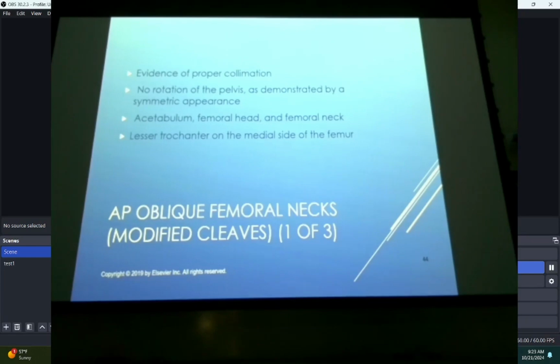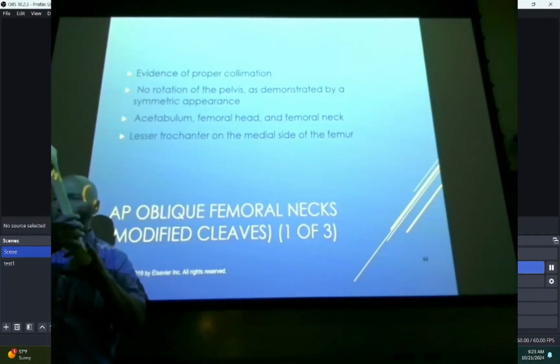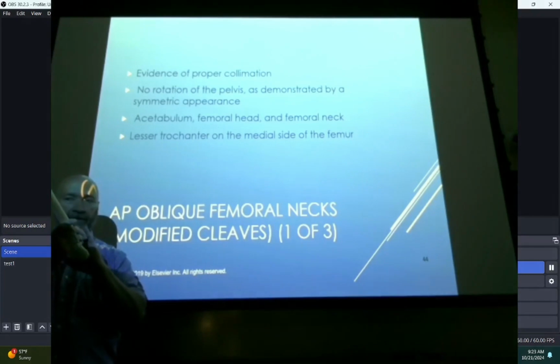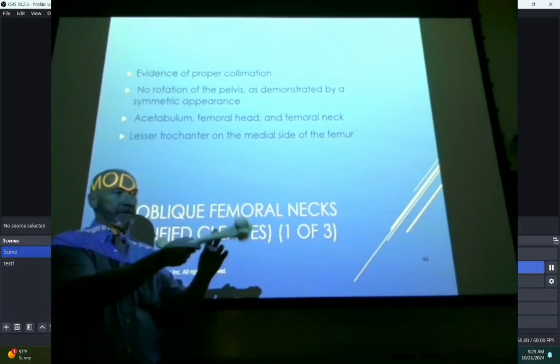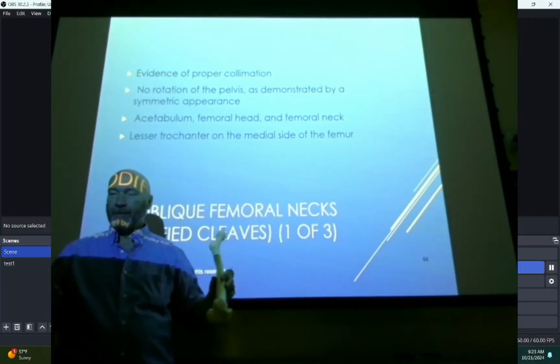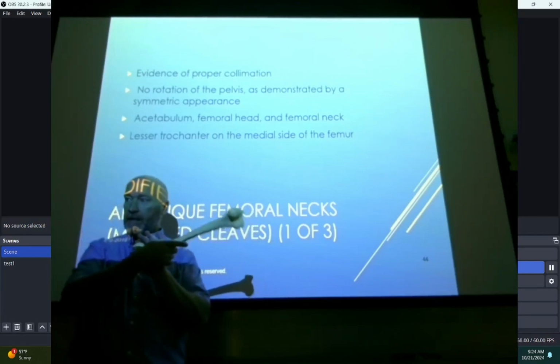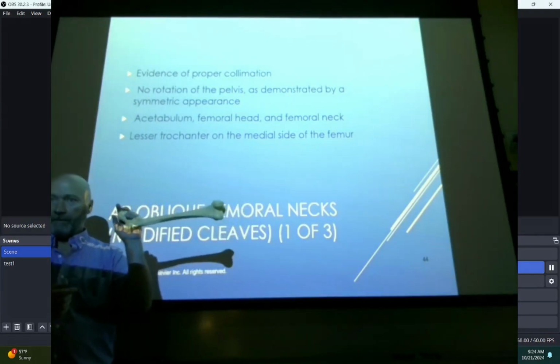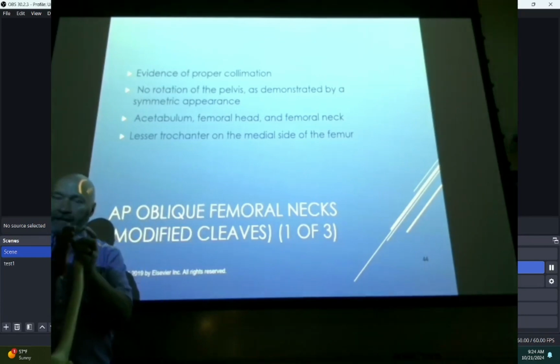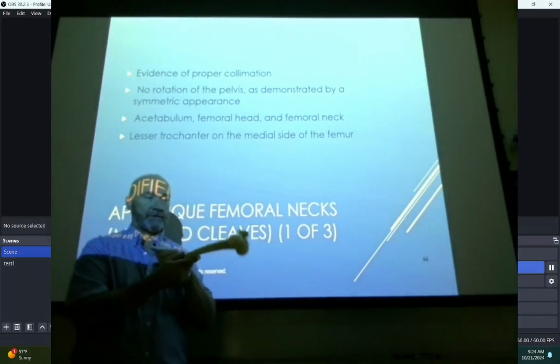It's pretty simple too. You might center a little bit lower, but what you're going to do is have the patient bend their knees up to about 90 degrees, put the sole of their feet together, and then have them externally rotate and abduct their femur so that it puts it as lateral as possible. Now, some of your patients aren't going to be able to put their knee all the way down. Encourage them to put them as low as they can, but some of your patients are just not going to be able to lay their knees all the way down like that. Put the sole of the feet together, because if you don't, they're going to slide under each other and you're just not going to get the result that you're looking for.